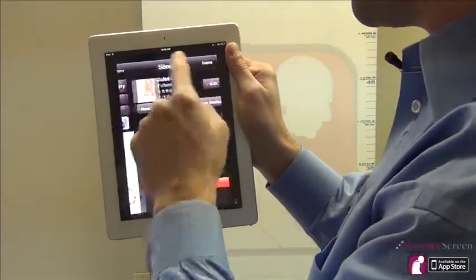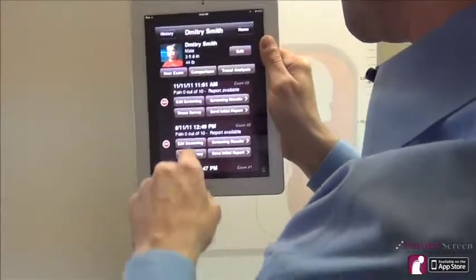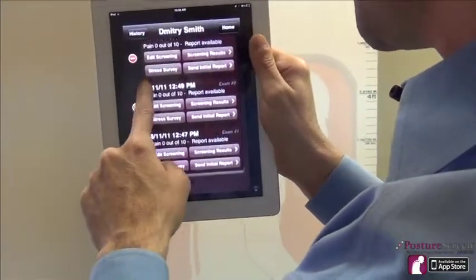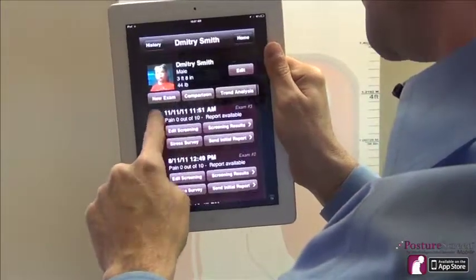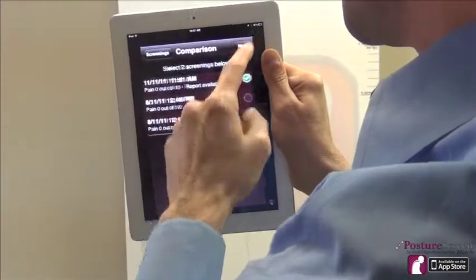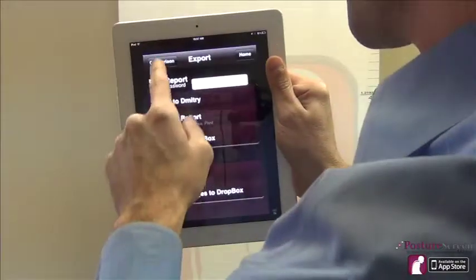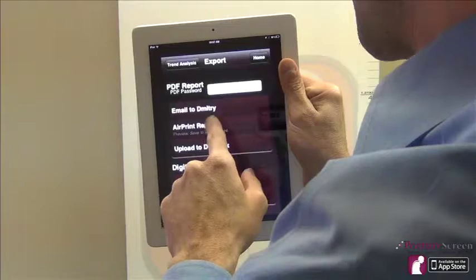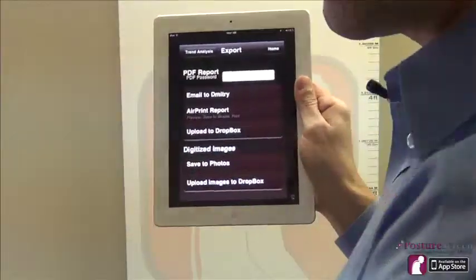The next thing I want to show you is Screening History. One of the things we've done is highlight the comparison and trend analysis regardless of whether you have a double exam on the patient or not. Doctors also wanted to know which exam number they were on, so now it shows exam 1, exam 2, exam 3 — that's new. If you want to do a comparison, you hit Comparison and you'll be prompted to do an assessment between two exams. For a posture trend analysis, we can have up to six assessments displayed. That's available in the comparison module.